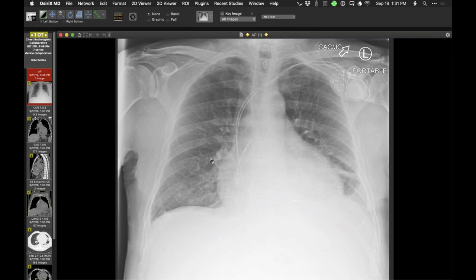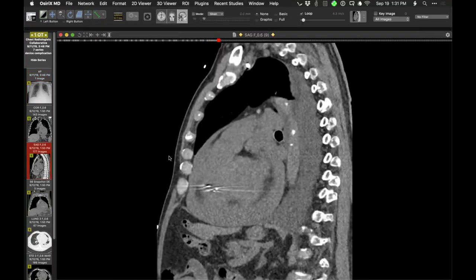Yeah, I don't know. I've never really thought about it that much. In terms of the height of that atrial lead, you're right. So, Howard, where is it in terms of anterior and posterior? Can we check the sagittal?